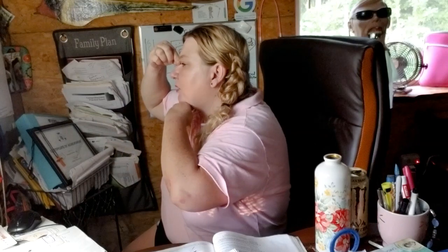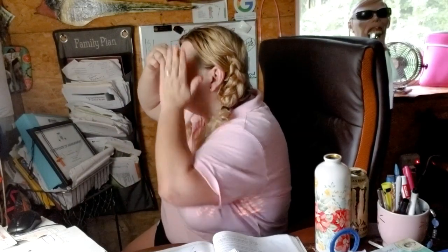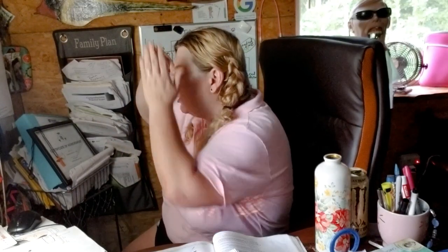If you get past the part where you think you're going to squeeze someone's brain in by pushing those things in their ear, make sure that their chin is parallel. I'll do it, even though you can see my double chin. But make sure it's parallel to the floor. And then you put those things in their ear with the adjustment right here. You line it up with the bridge of their nose. And then what it's going to do is take a side profile of that patient, okay?